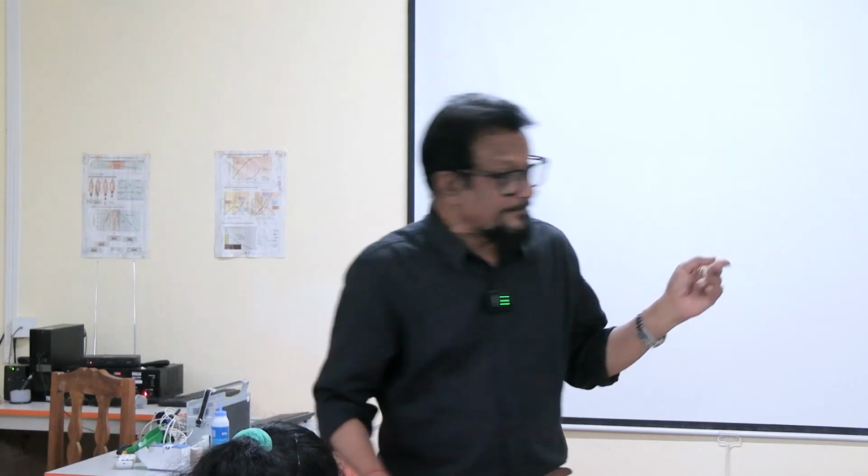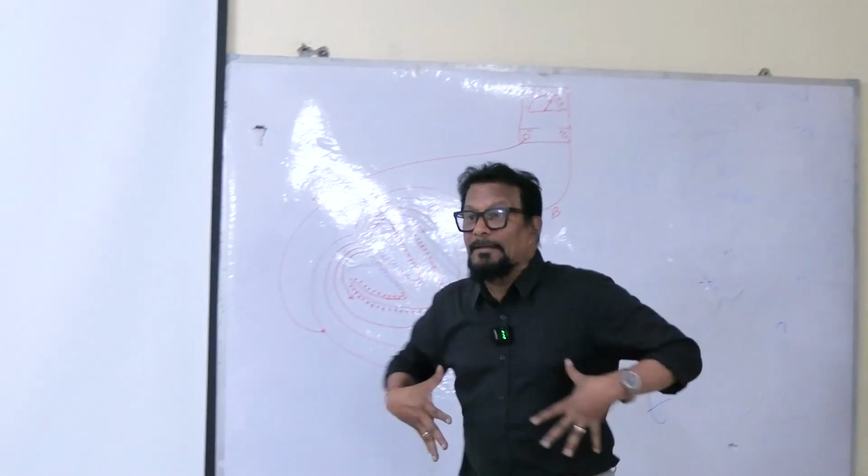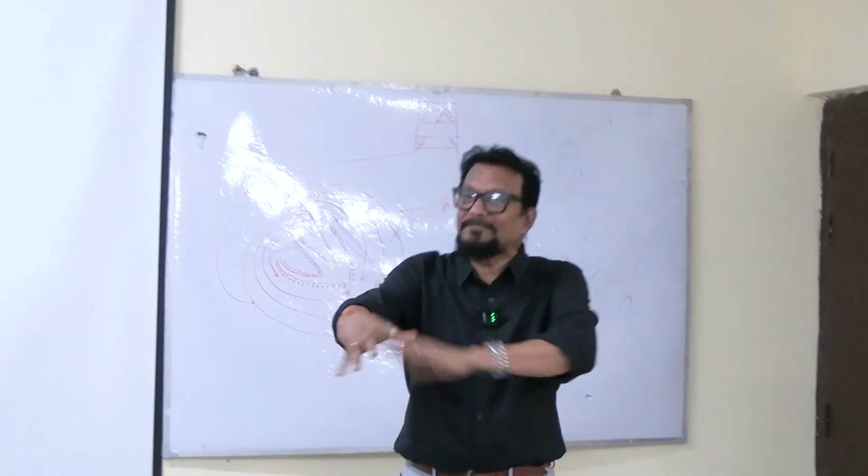Since the heart is within a volume conductor, our body is having a lot of fluids, and these fluids are having ions. So now electricity can move easily, means current flows easily. So the current which was generated here can be transferred to my skin also.